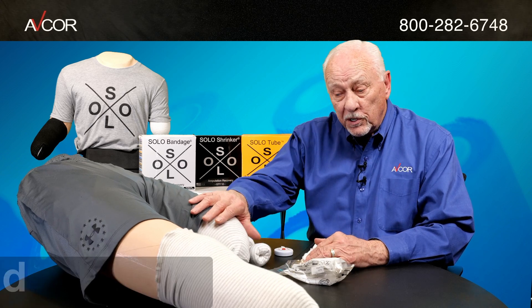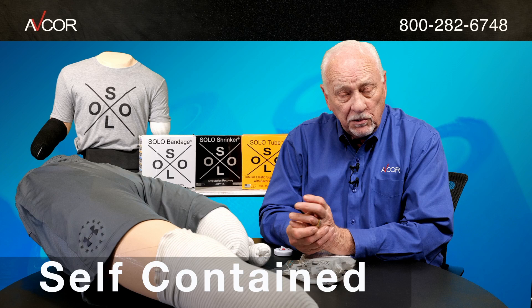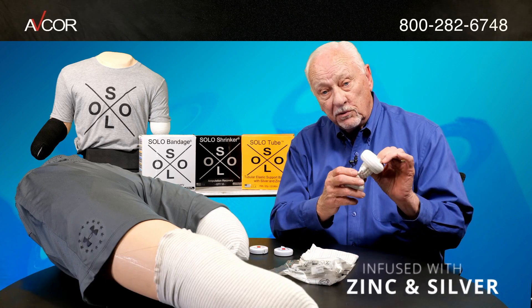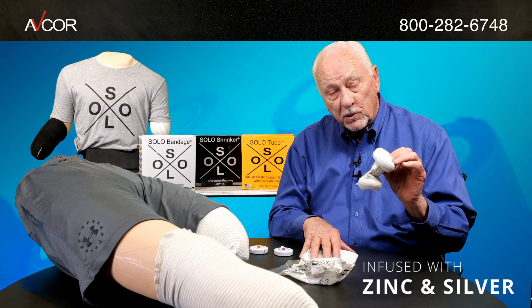Our products, as you see here, are totally self-contained. You don't need elastic bandages or anything else. The bandage itself is zinc and silver infused, as is the Shrinker product.